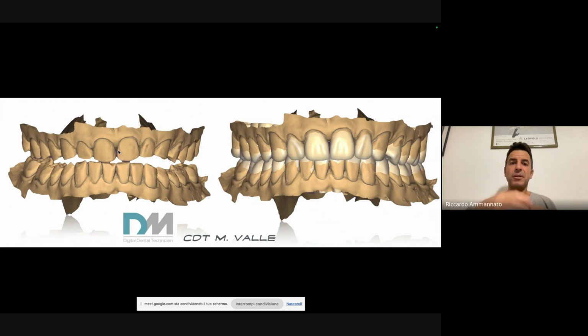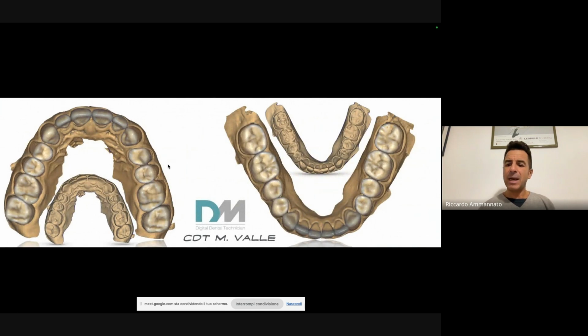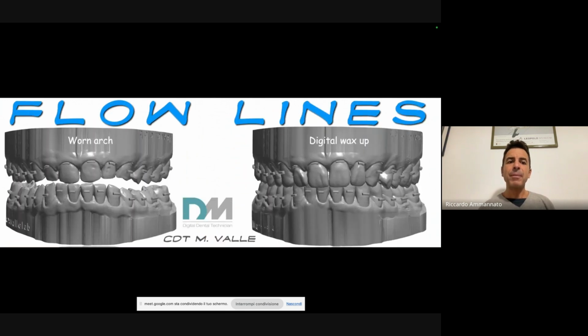Okay, so we're starting from here, open the vertical, is the wax-up, you can see it here, the digital wax-up also.